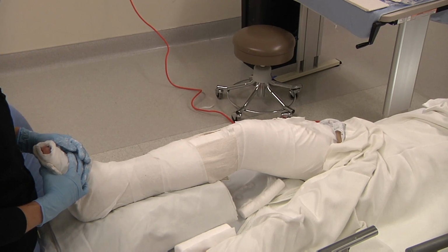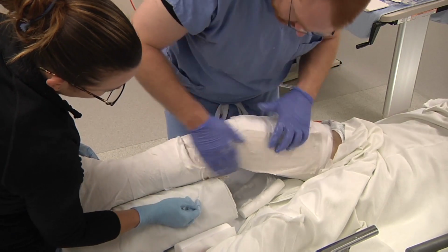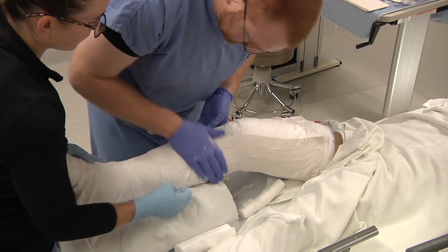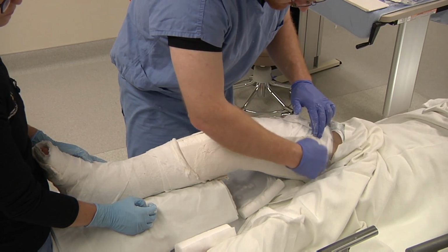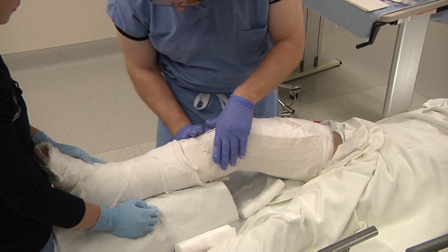Do that. Really get as much as you can. Integrate that long leg extension piece into the lower leg. Get your hands a little bit wet. Interdigitate them as much as possible. Laminate them. I like usually having the bent portion up at the top so that there's not a lot of loose frayed pieces up there, and the loose frayed pieces can help down here.